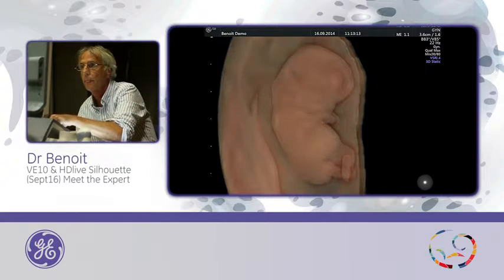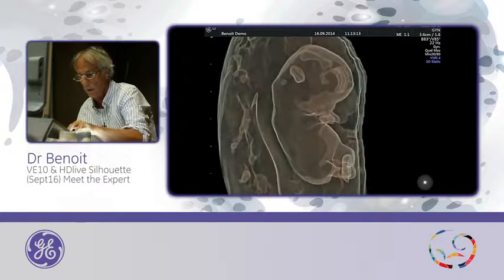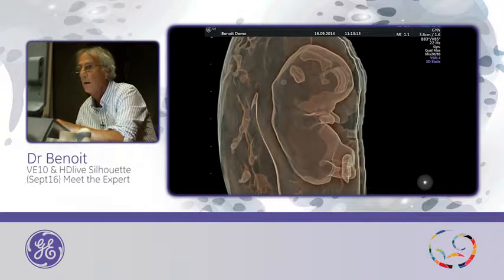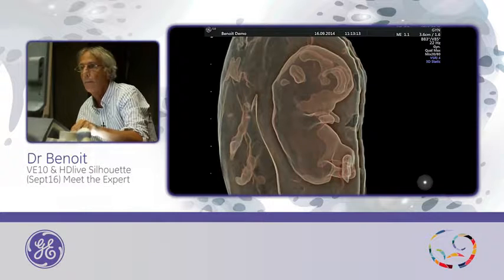Then, and now the brain cavities. Again, I will reduce transparency. Reduce again.